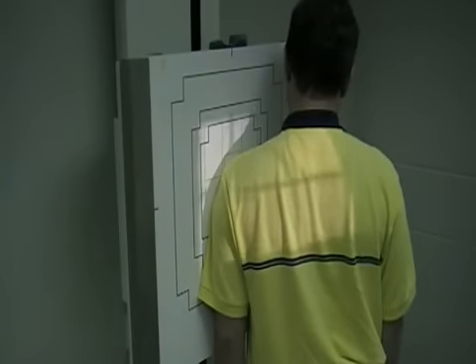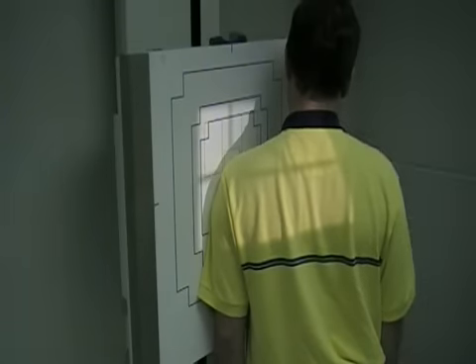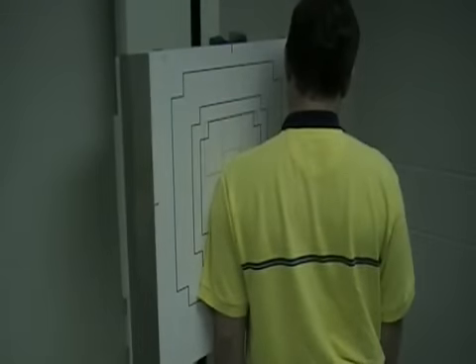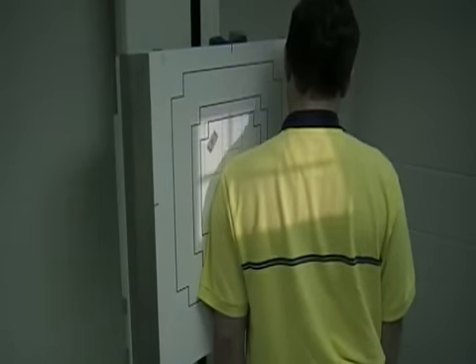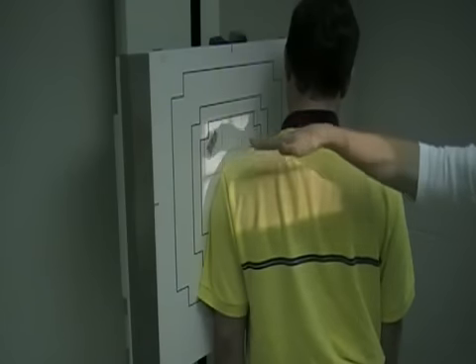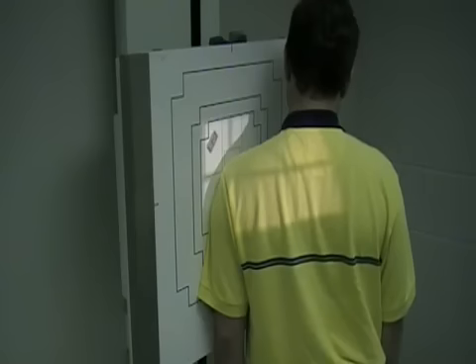Now I can go actually a little bit higher, and this is showing the supraspinatus outlet. Then we'll place our left marker, since this is our left shoulder that is against the IR, and we can collimate just a little bit. But this is going to skim over the shoulder. Just catch that top edge and it will show the supraspinatus outlet. And this is the Neer method.